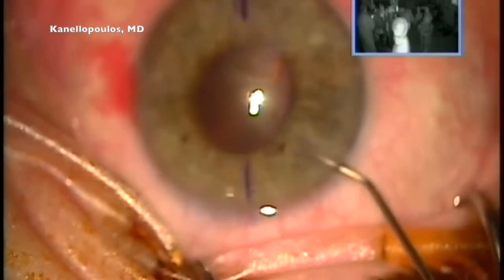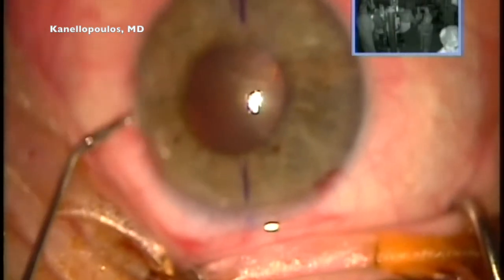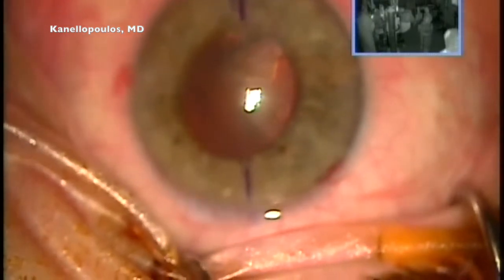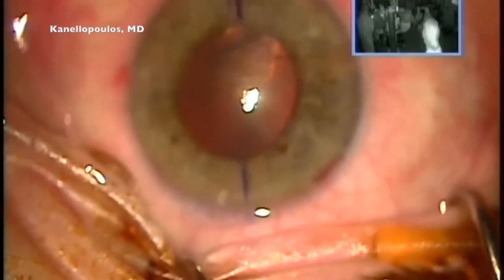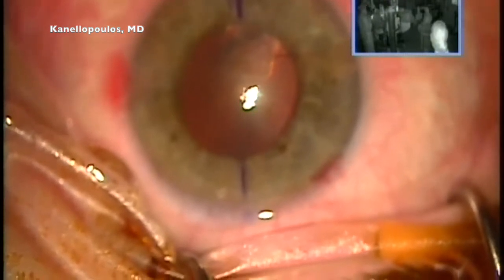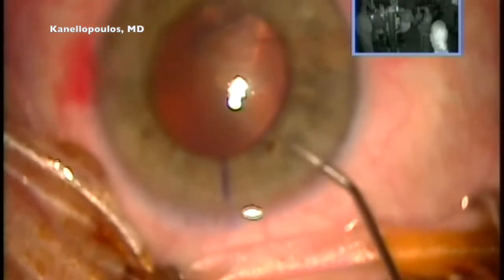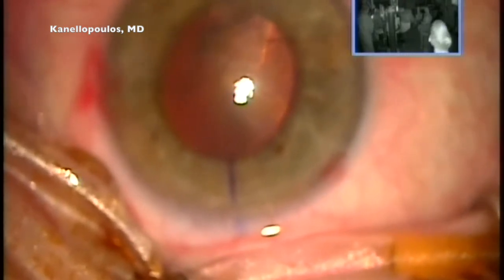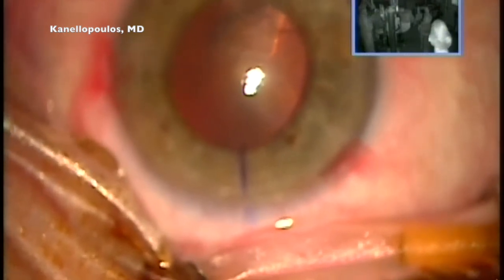So, first epinephrine, and we'll see a very nice response of the pupil once the mydriatic is introduced intracamerally, and then we will use air after we get sufficient dilatation of the pupil in order to use blue dye and better define the anterior capsule, because once we get to that quadrant of the very fuzzy cornea, we will have difficulty visualizing our capsulorhexis front.